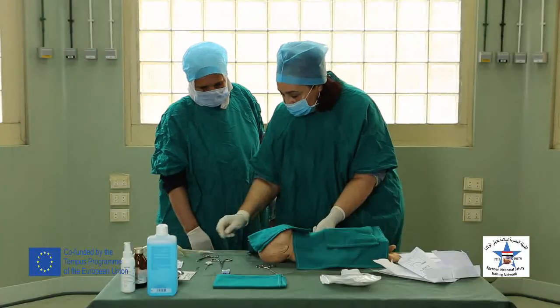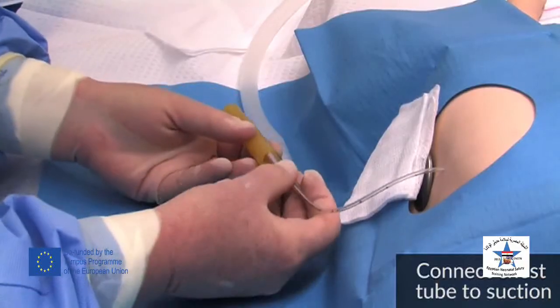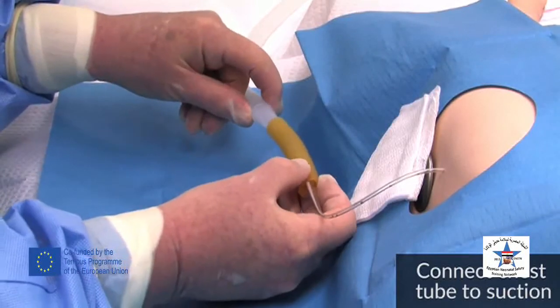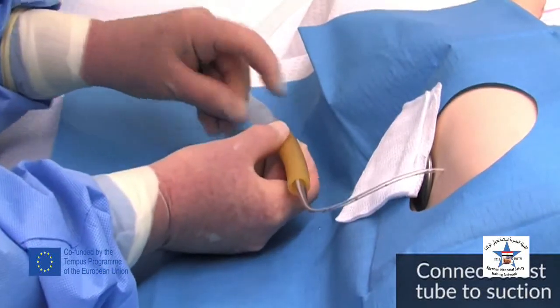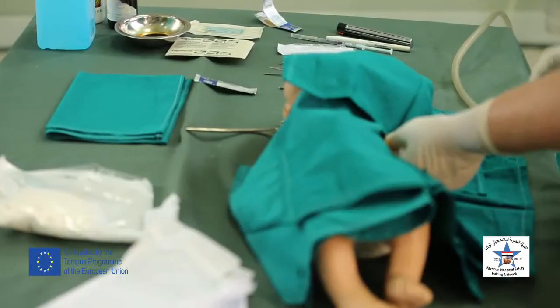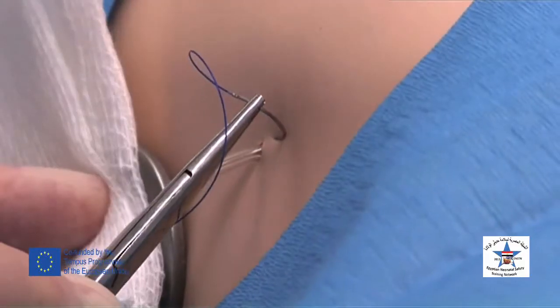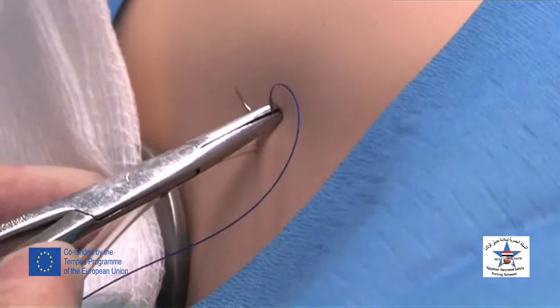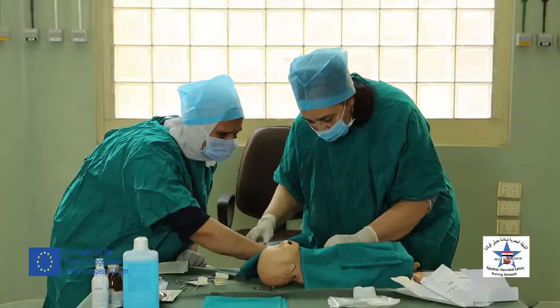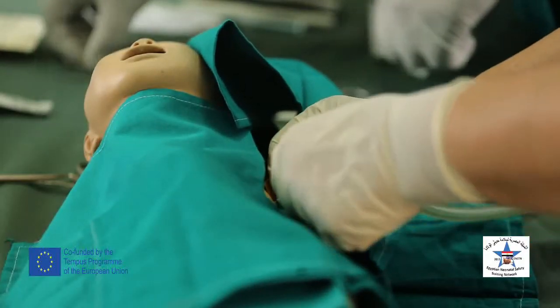Then I will connect the chest tube to the two-way connector of the water-sealed bottle and open the clamp to watch for bubbling of air. Now I will fix the chest tube in place. I will stitch the skin, one side of the incision. I will take one stitch. I will rotate the thread, and then I fixed the chest tube in place now.